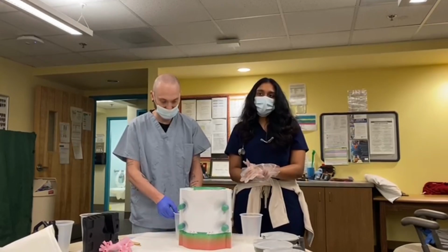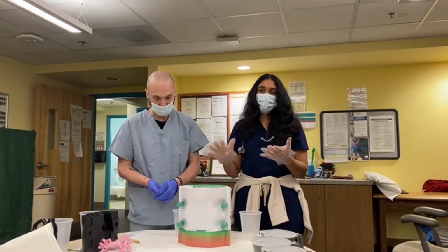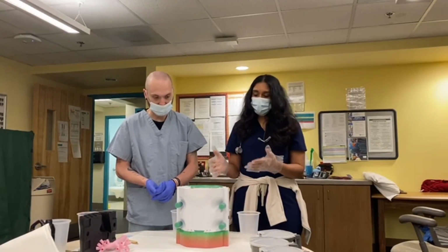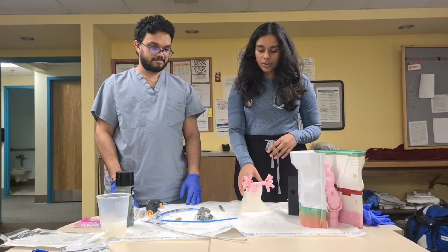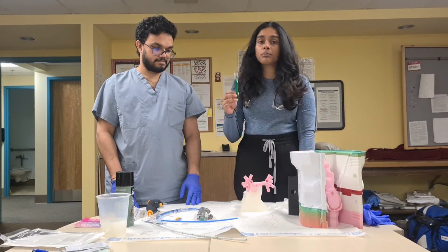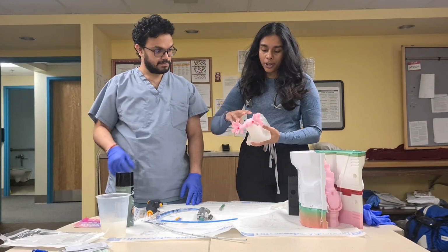So we'll be back in about 5 to 8 hours, when the surface of the silicone feels not too sticky to the touch and we think that the inside has set. Okay, so now that we've done that, we used a blade and cut off all the excess little silicone scraps to get our final model over here.